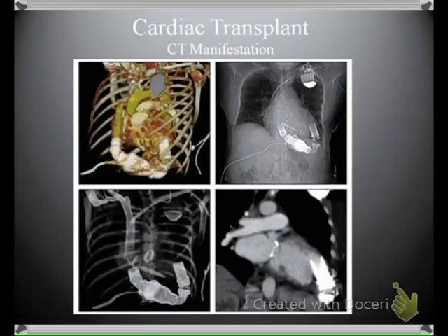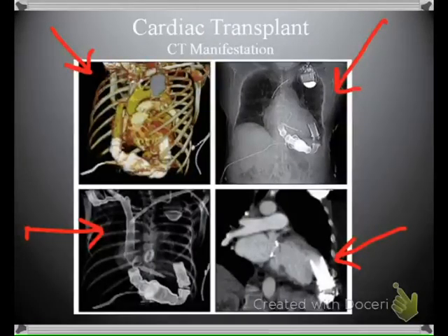We have a left ventricular assisting device, as demonstrated by this picture. We see a 3D reconstruction here, the scout view or the scanogram here, and then just a removal of detail to allow us to see the device there. Basically, the left ventricular assisting device means that the patient has had their left ventricle develop some abnormalities. Perhaps the left ventricle has become stretched and dilated to the point where it cannot contract enough to generate enough force to actually pump the blood out.